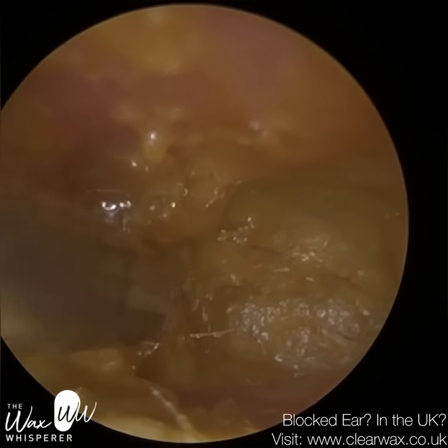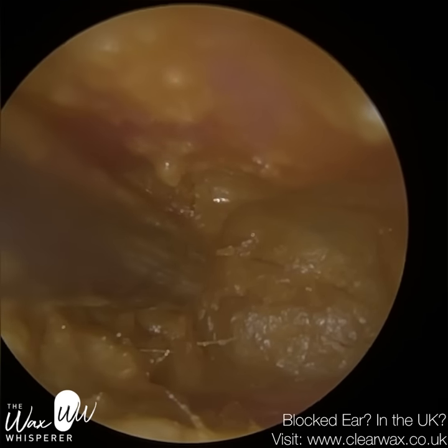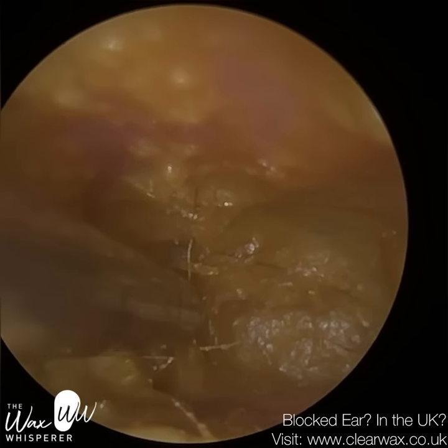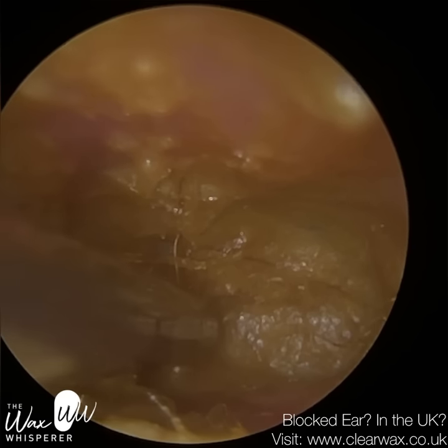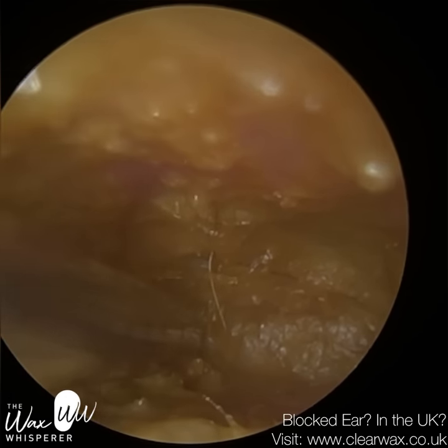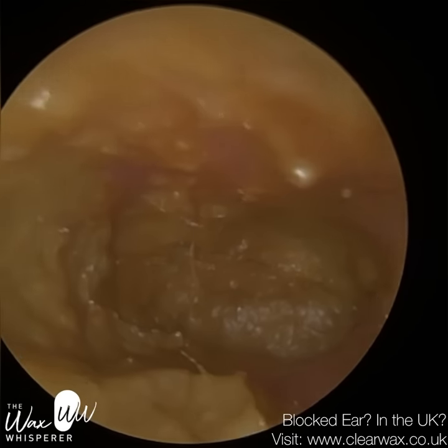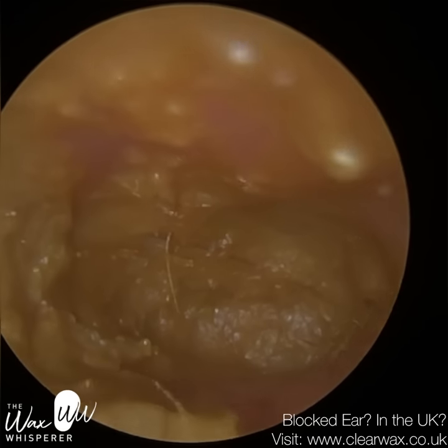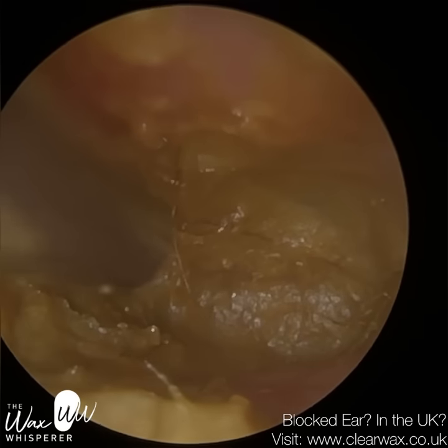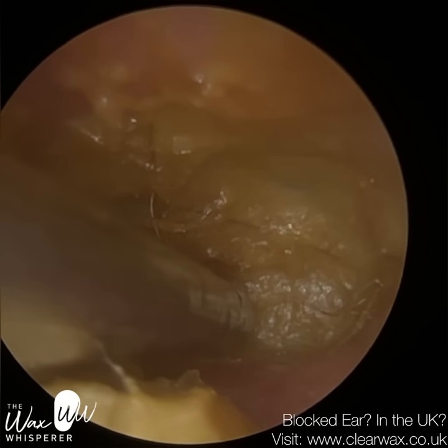If this patient were asleep with some anaesthesia, we could probably be a bit less conservative. But the patient's awake, and as an audiologist in the UK, we can't prescribe or administer any local anaesthetic. We do sell a drop set called clear relief drops which contains topical lidocaine, but that's not going to be enough in this instance — it's a very low over-the-counter dose. If you've got a bit of discomfort or water in your ear, the lidocaine can help numb it slightly, but in this case it's just not going to have much of an impact.